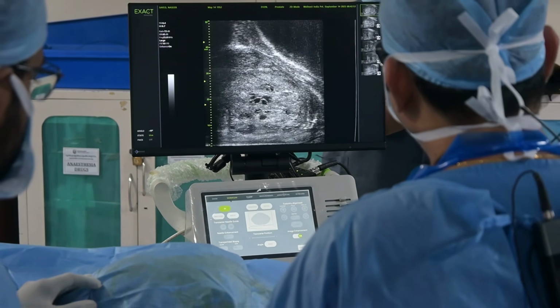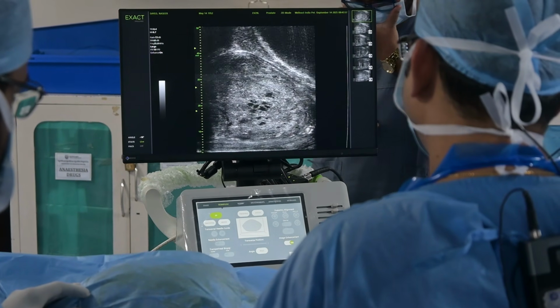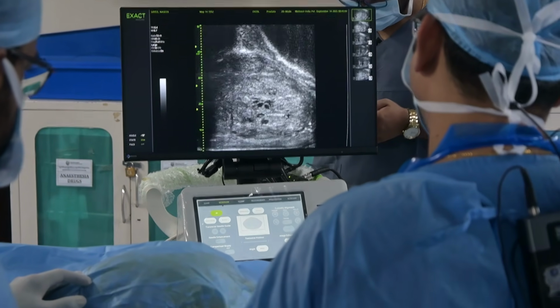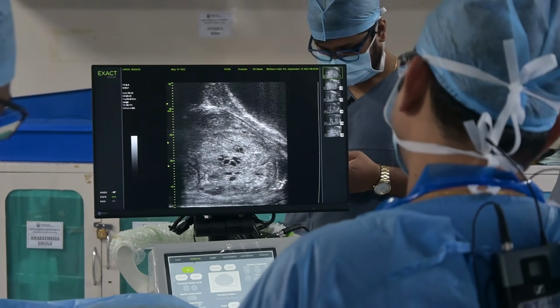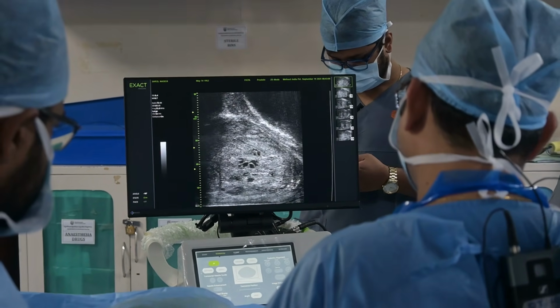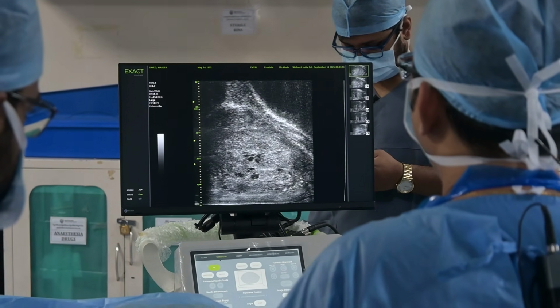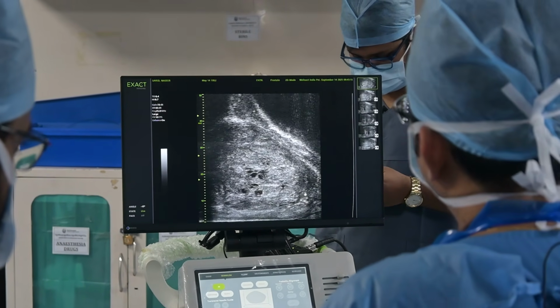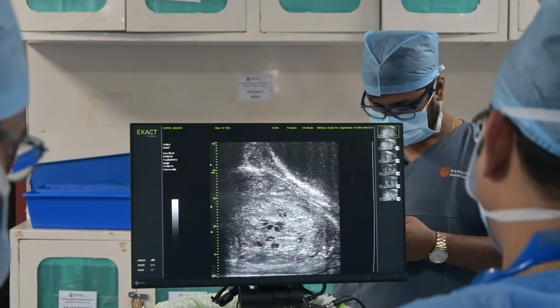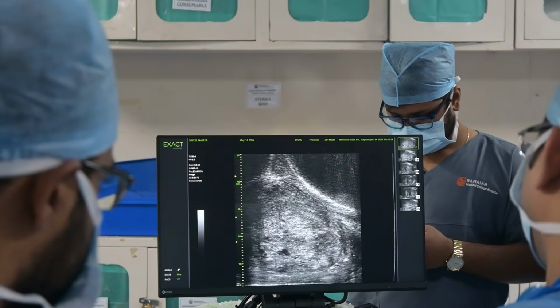Okay, sir. Now again, in the center you see some dark patches. Yes, sir. These are normal ductular patches. The magnification of micro-ultrasound goes to 70 microns. A single ductule is about 120 to 150 and can range up to 250 to 300 microns. So when you scan up to 70 microns, the details of each ductule can be visualized.